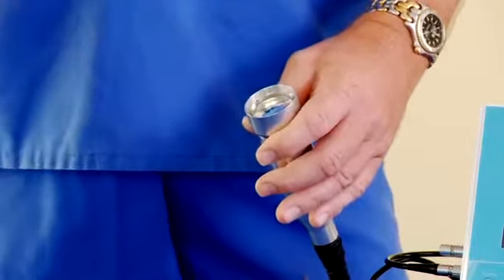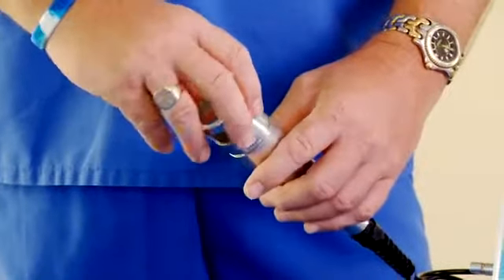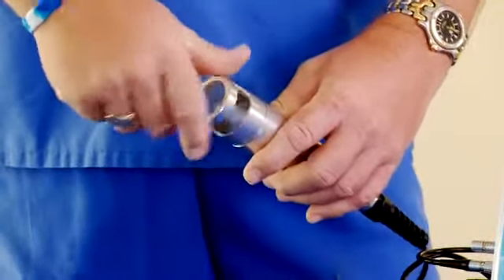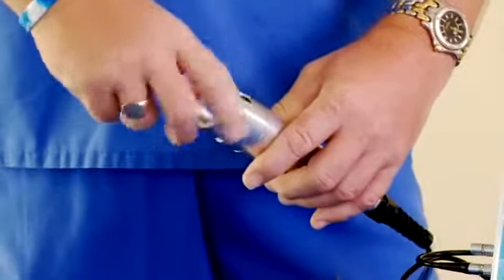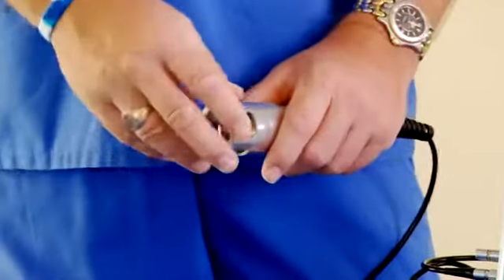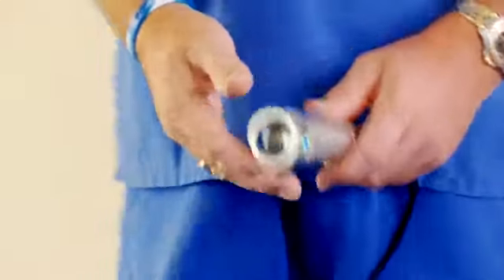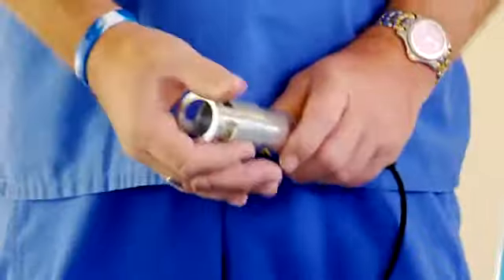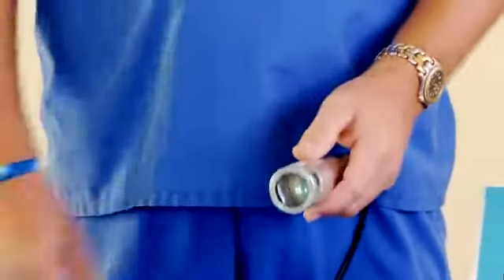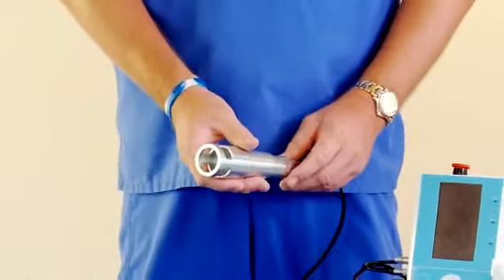After you've cleaned the lens with the Goldway cleaning kit for the lens, you can put the standoff back on. Simply screw it on. Goldway will offer multiple standoffs, so if you want to clean and autoclave all of them and have multiple for use, you can. We're also working on a plastic disposable cover that will go on the handset and be used as a one-time use only.